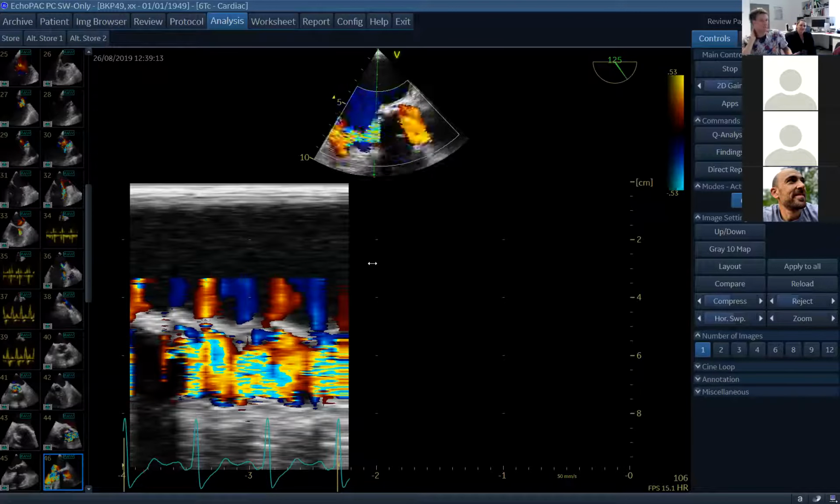Yeah, nice, one dimension. And the next thing I was going to talk about is that if the jet's not central, it's eccentric. If it goes across underneath, then you'll get a false impression of it. And that's going to be the same.